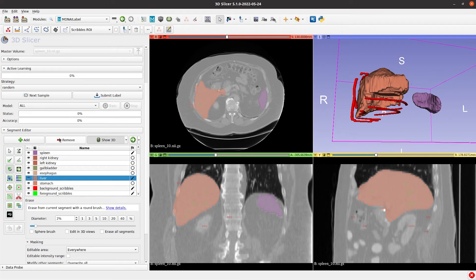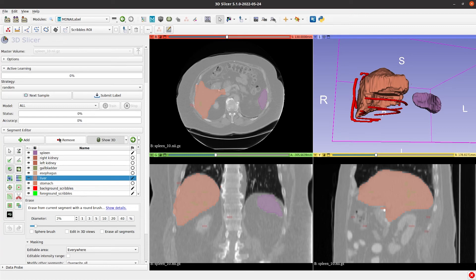As you can see, the Scribbles algorithm is very similar to the Grow from Seeds functionality presented in the previous video. Based on Seeds or Scribbles, this algorithm allows us to create labels from scratch. Those labels can be used to train our AI model.